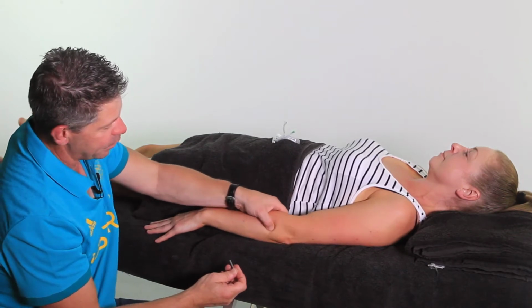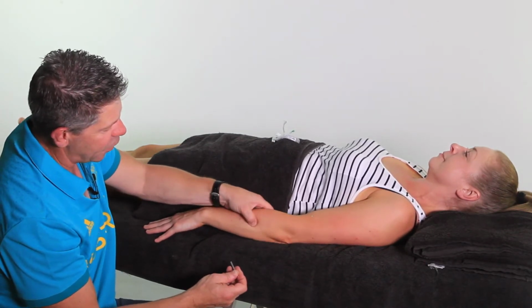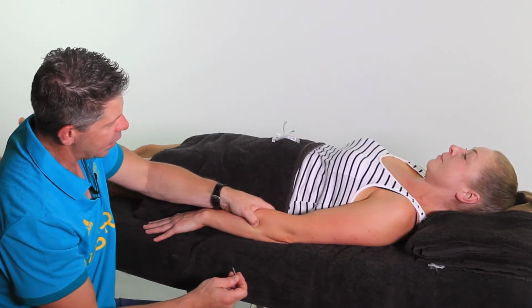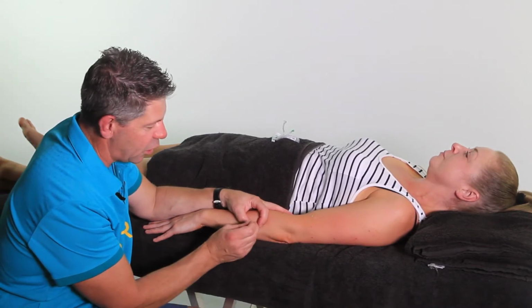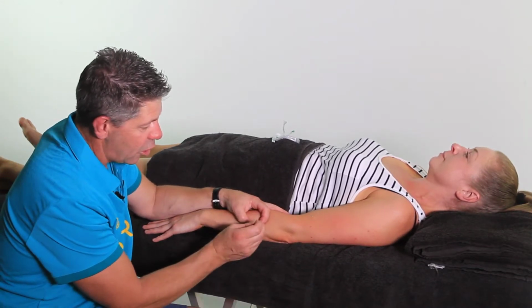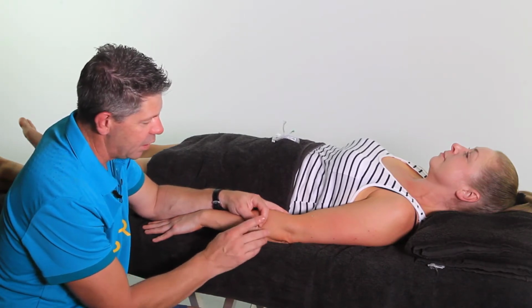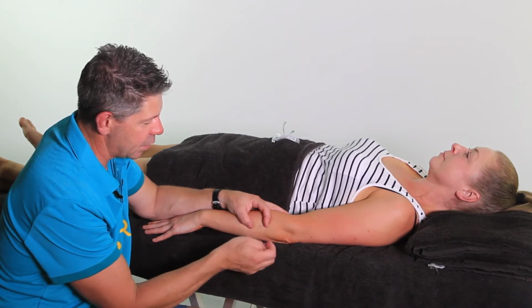So with extensor carpi ulnaris, you'll find that the trigger point is sort of a mid-third way down from the elbow here. Is that tender through there, Ali, about there? Okay, so once we locate the area, that's it there. I put 2 fingers either side of it, spread the skin so I know that's the area that I'm going to. Place the guide over and then just tap that in, okay?